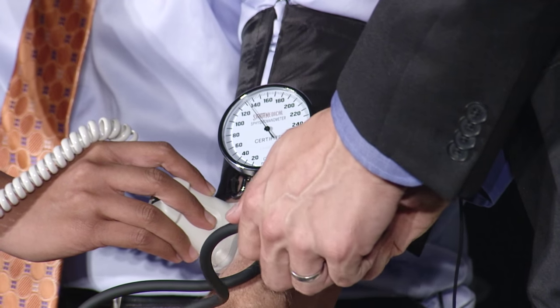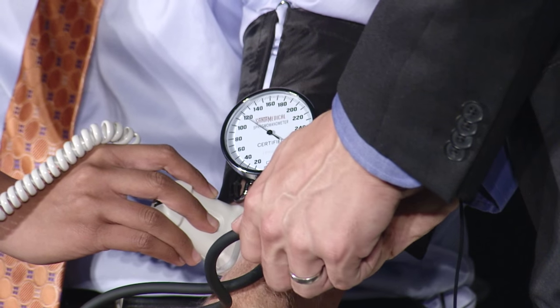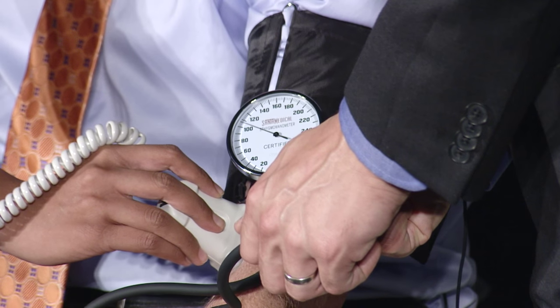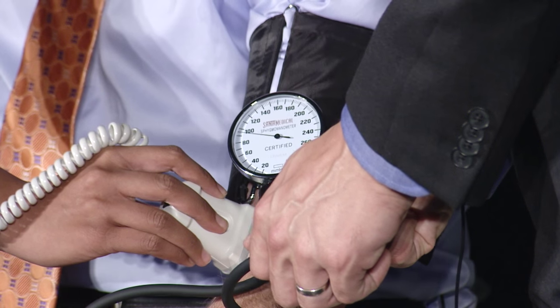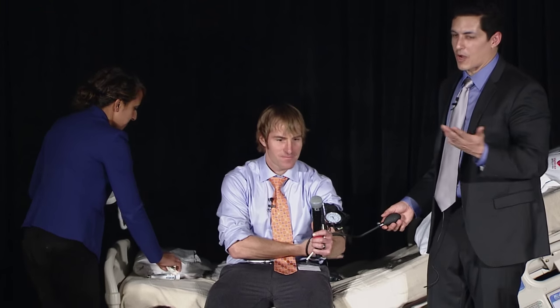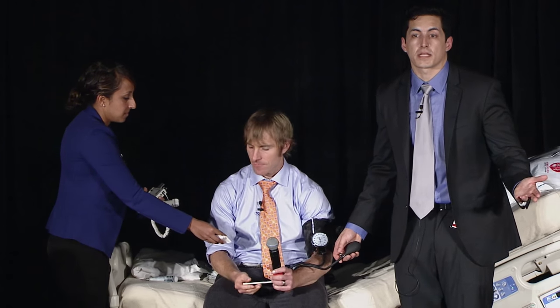Going down by 5 or 10, checking at 100 — it still goes away a little bit but it's starting to come back. About 95 it will still be persistent. So about 140 down to 95 — that's the difference. That's exactly what you do: if you have a patient who is tachycardic, short of breath, maybe with distant heart sounds, you can throw an ultrasound on and see fluid around the heart, then do pulsus paradoxus and know immediately if they're in cardiac tamponade or not. These are the things we want our residents and doctors to know at the bedside.